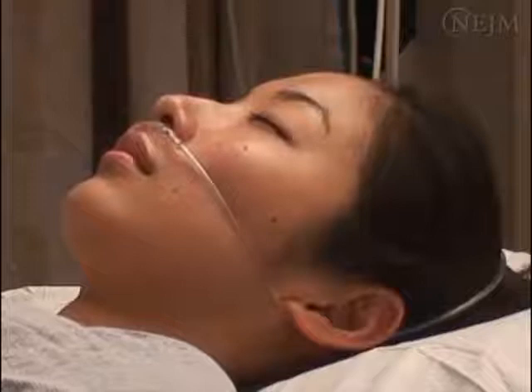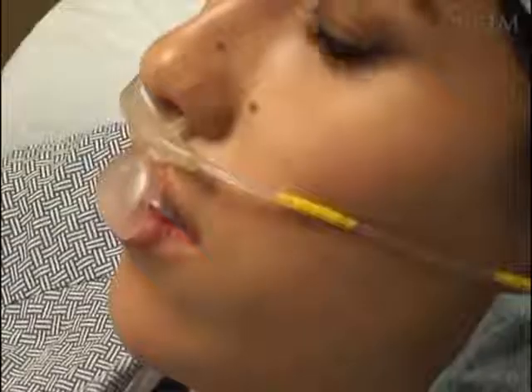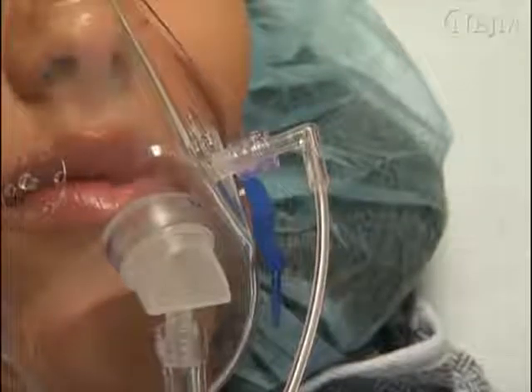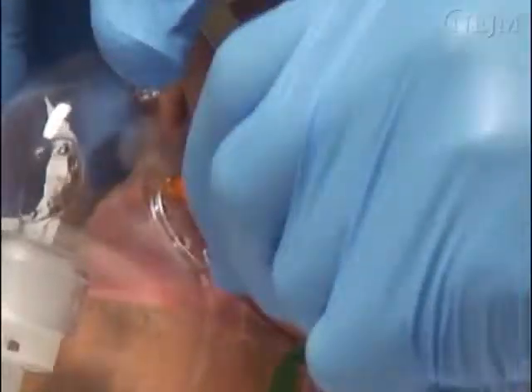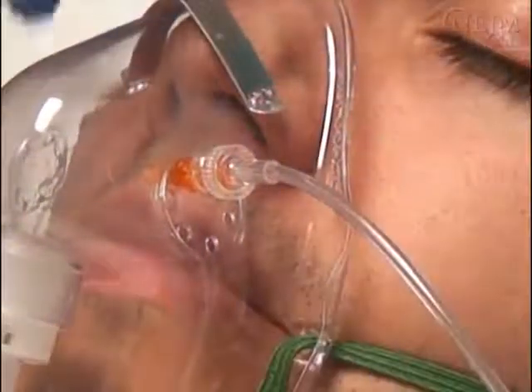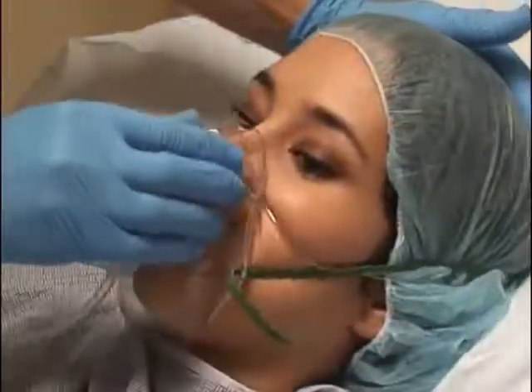However, in patients who are not intubated, side-stream capnographs can be used conveniently with a face mask or nasal cannula to monitor respiration. Nasal cannulas and face masks that feature integrated CO2 sampling are commercially available. You can modify standard face masks by attaching the sampling line directly to the orifice of a mask, or by securing the sampling line inside the mask. Take care that the orifice does not rest against the patient's skin to avoid occlusion of the flow of gas into the sampling line. Alternatively, you can place an integrated sampling nasal cannula underneath a face mask.